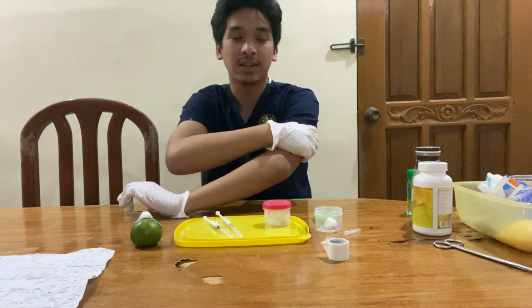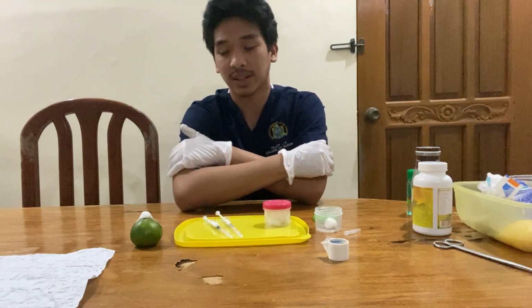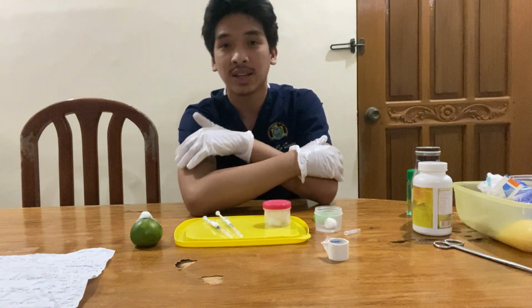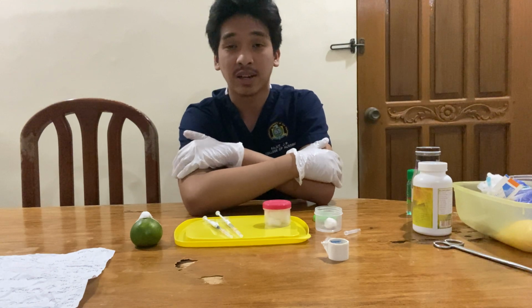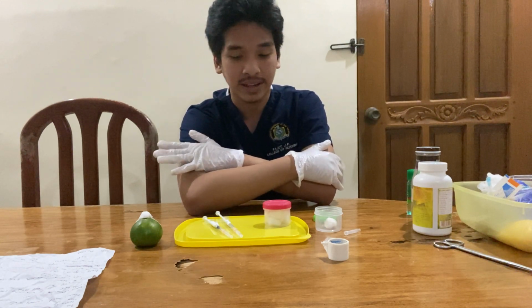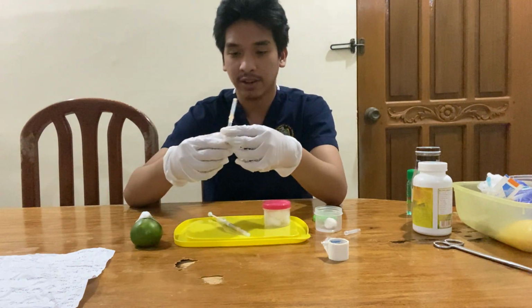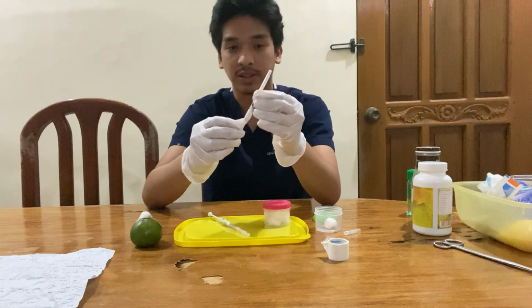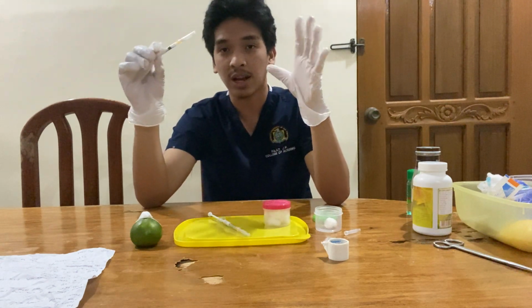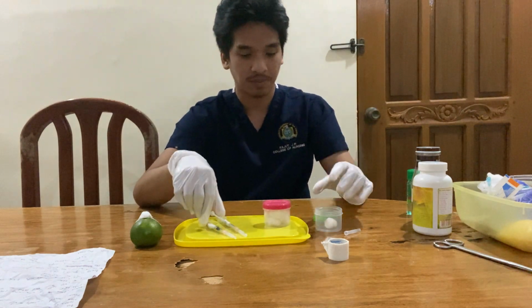Okay, something right here, and on the other hand of the patient, and we'll check for tenderness and hardness and softness. If there's none, then that will be the ideal site of injection. So now double check again if it's the insulin. So it's the insulin. We'll now perform the injection.